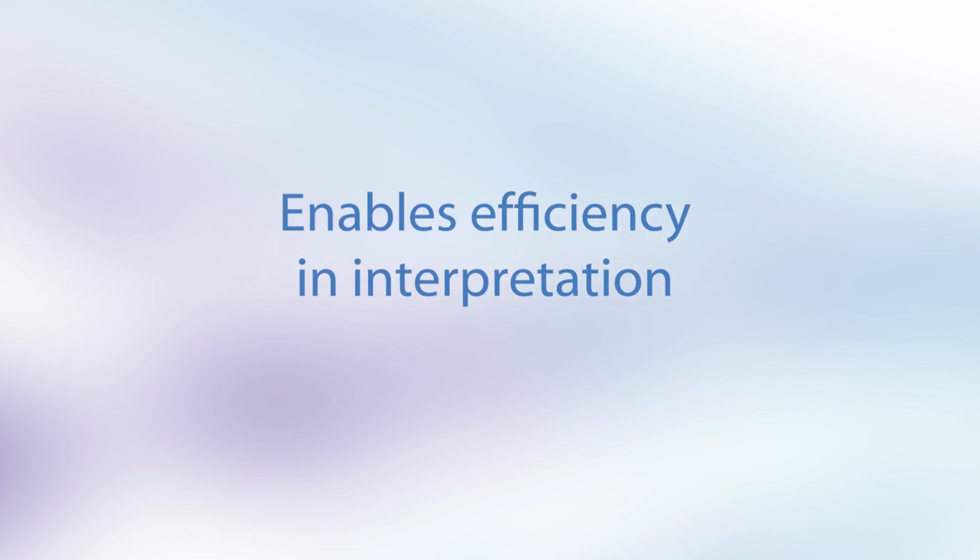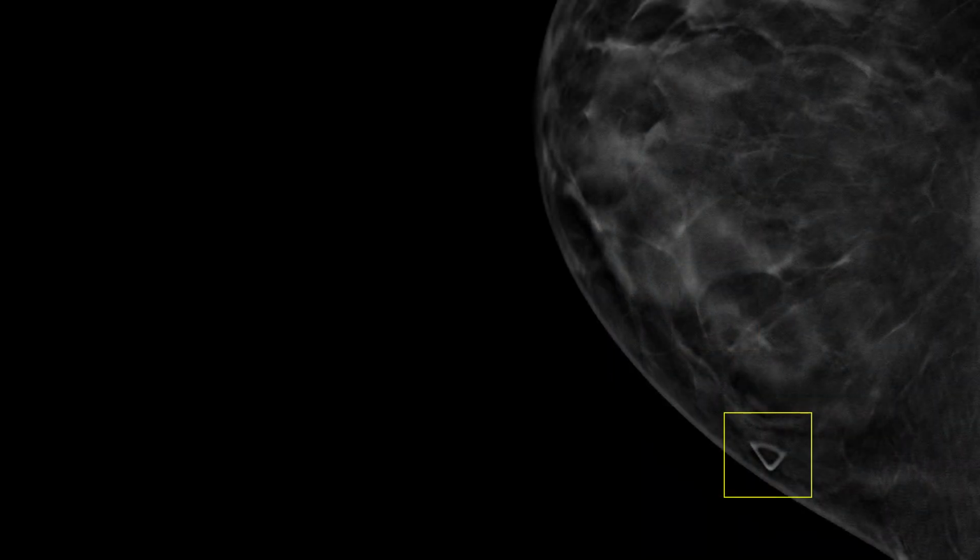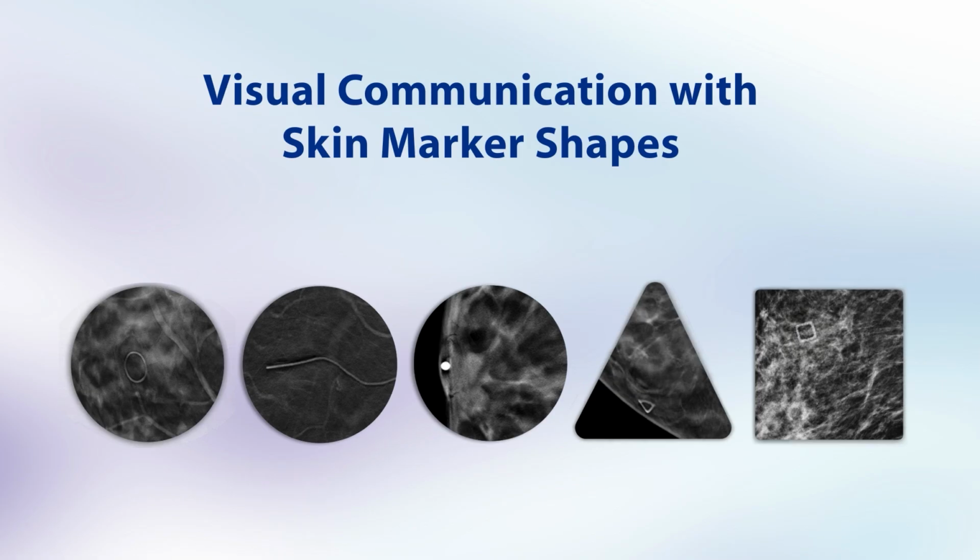not miss anything, and be able to quickly look at a mammogram and know, oh, that's just a skin lesion. Oh, that's a palpable lump, something I have to obviously be working up, versus that's a scar, or there's an area of focal pain, or whether it's a nipple marker. Making sure you are able to quickly recognize that the technologists are giving you that information really makes our job easier, which again is really important in a busy practice, as I'm sure many of you are in, and you really want to make sure you're able to get through your cases as quickly and efficiently, but again, not missing any lesions.